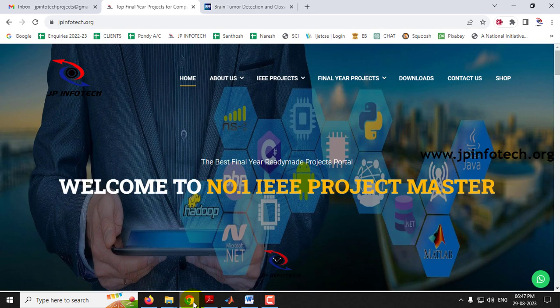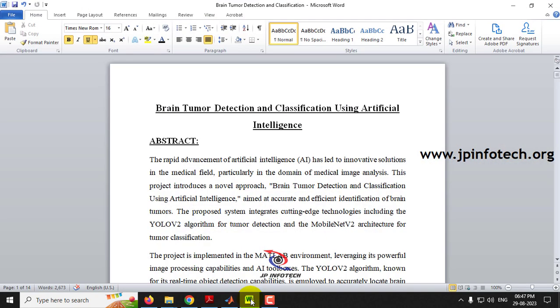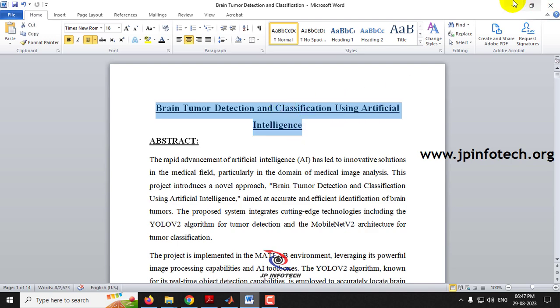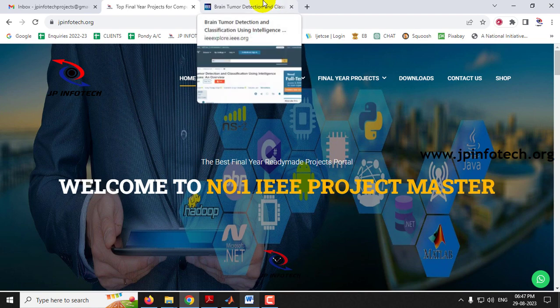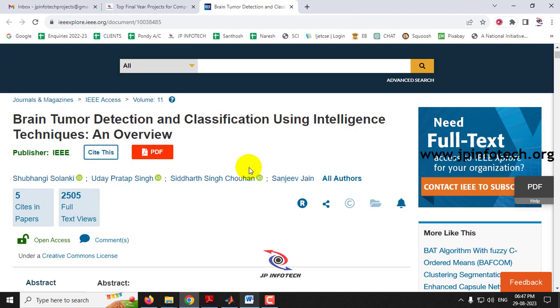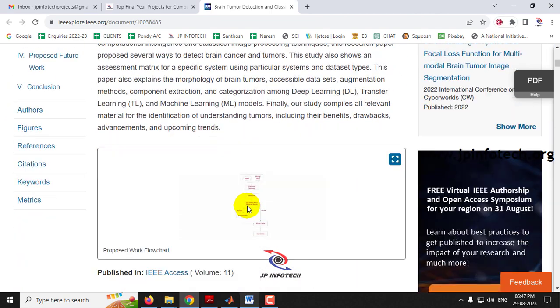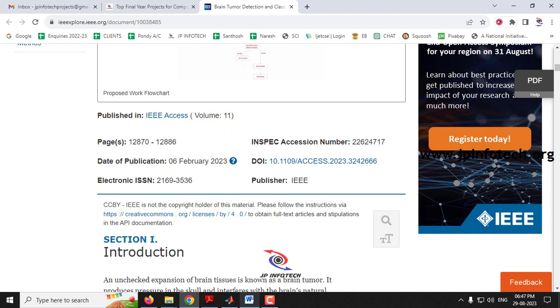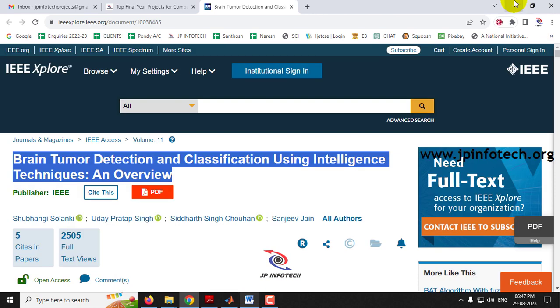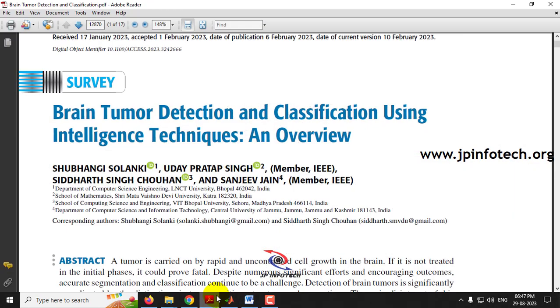In this video we are going to see a MATLAB project entitled 'Brain Tumor Detection and Classification Using Artificial Intelligence,' which is an IEEE 2023 journal paper. The base paper is referenced from IEEE and has the title 'Brain Tumor Detection Classification Using Intelligence Techniques: An Overview,' published in IEEE Access 2023. Before seeing the execution of the project, let me brief about it.